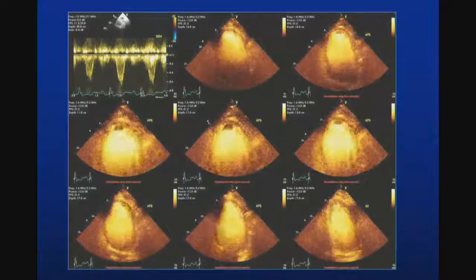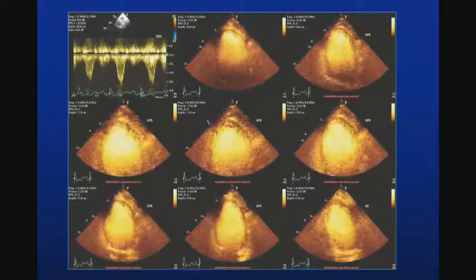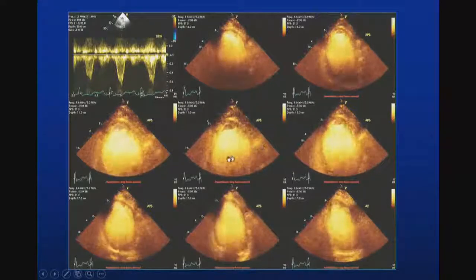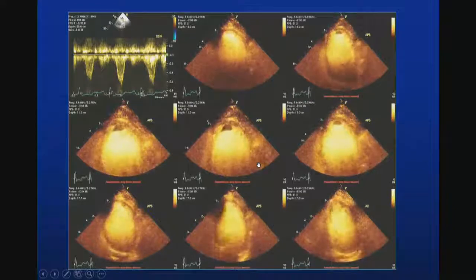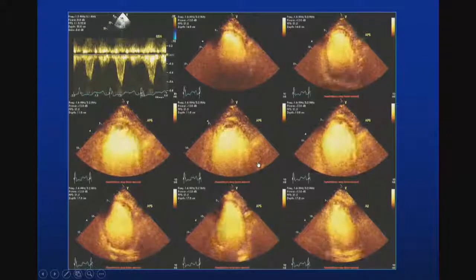Contrast will enhance the imaging overall. And there is a surprise: obviously a thrombus at the tip of this heart, with a negative contrast in there. And also, I can tell the anterior wall and all. It looks like a diffusely abnormal heart with some areas of akinesis, but certainly there isn't a single segment that contracts well at all. Let's take another example here.